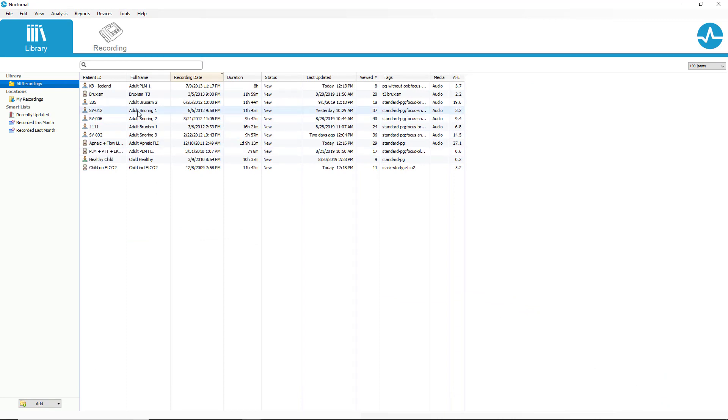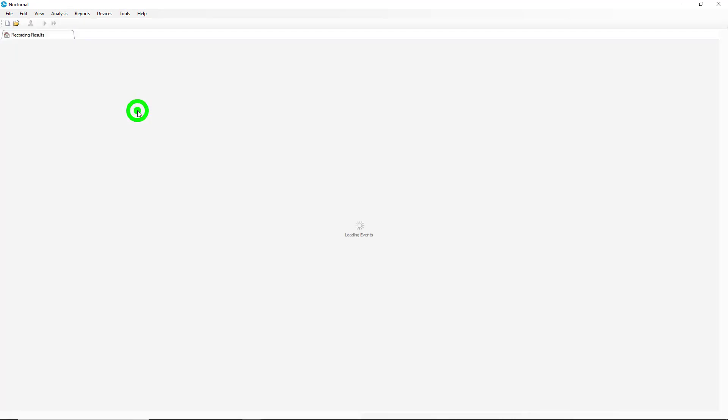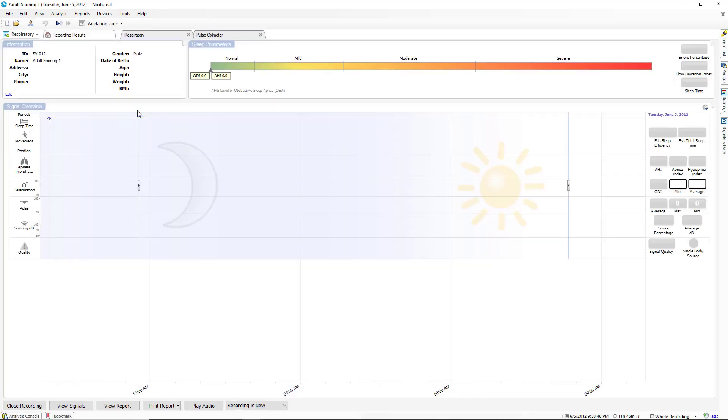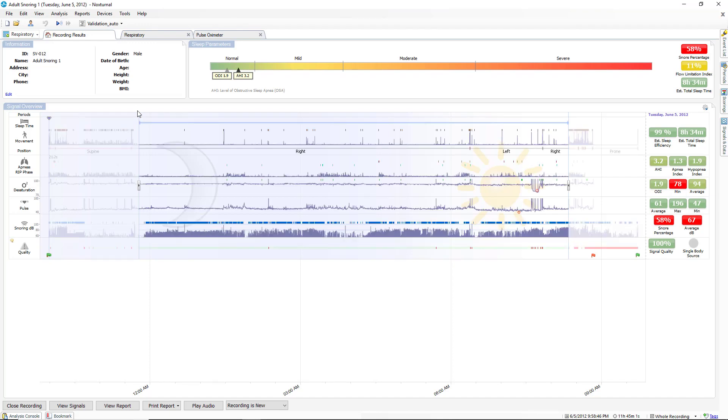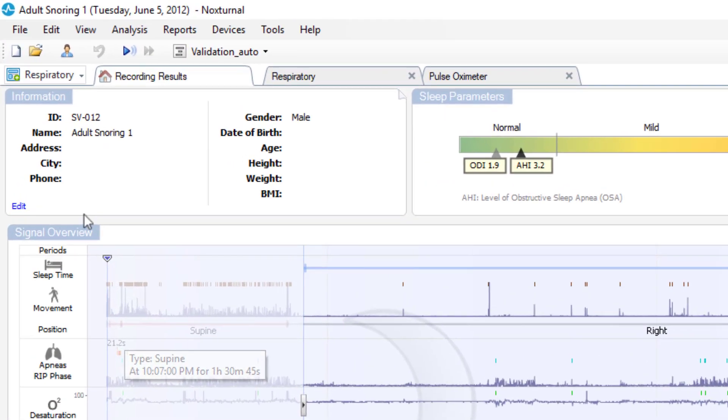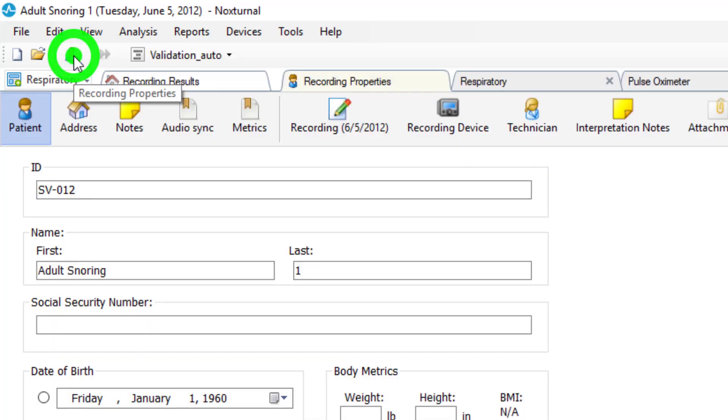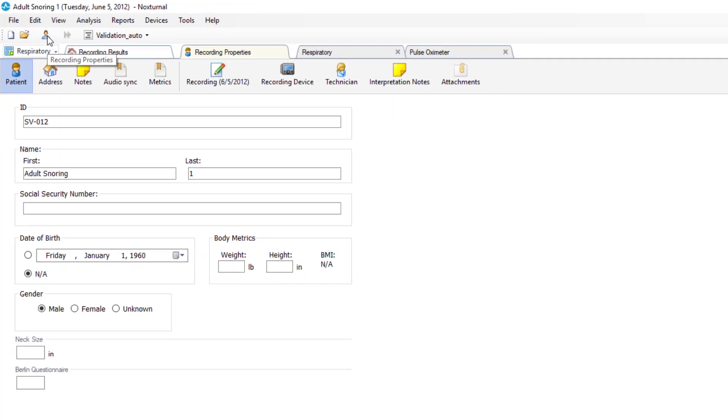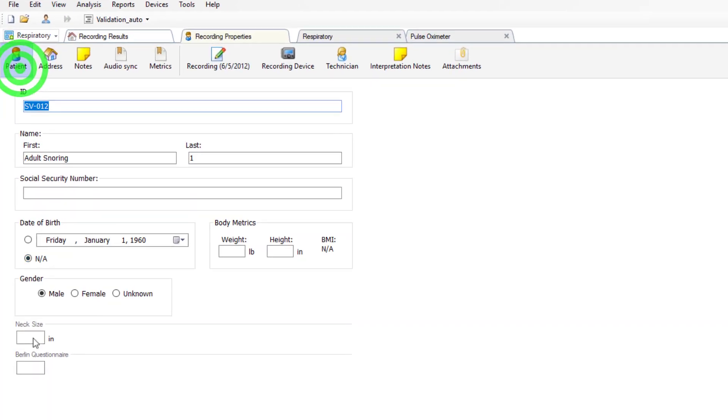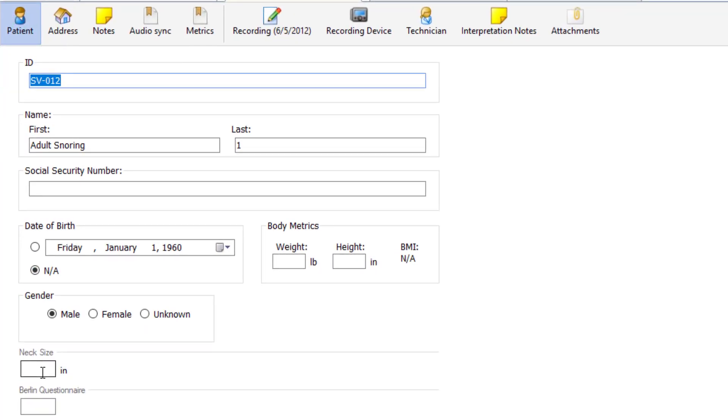So now if we open a patient study, we can go to the edit screen to edit this patient information or up to our icon bar and click on the little head that indicates recording properties. You can see now under our patient tab we have an item for neck size. We can enter in say 17 inches.